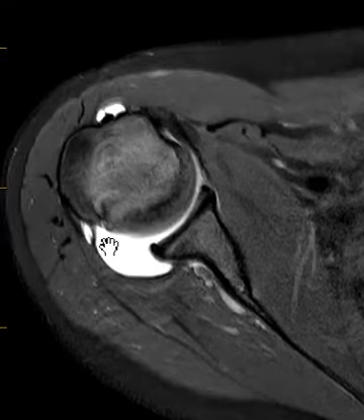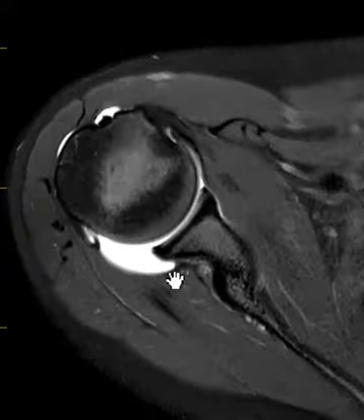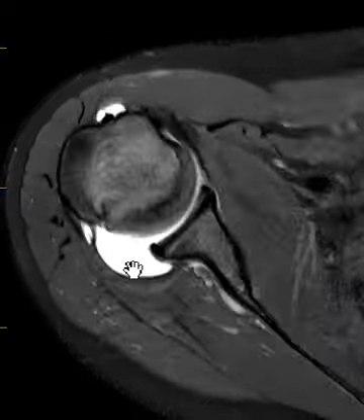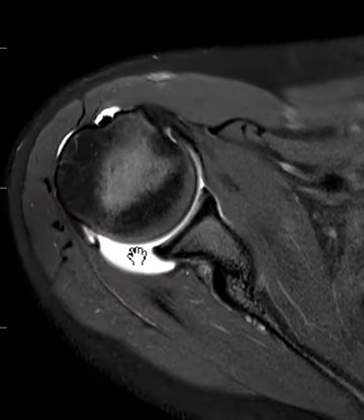Normally it will attach very close to the edge here and will be much smaller. In this patient, it attaches more medial — almost one centimeter medial to the glenoid rim. This medial attachment and this laxity here, you can see how lax it is, allows the fluid to bulge backwards. This can result in posterior shoulder joint instability.